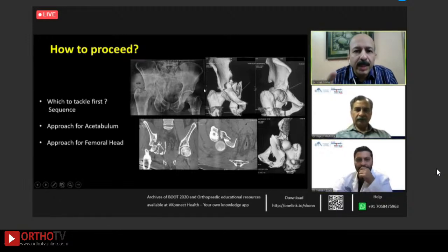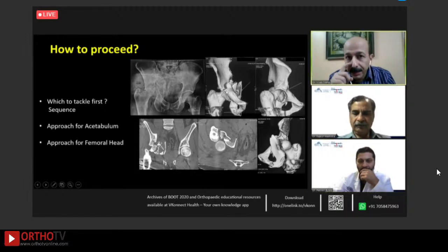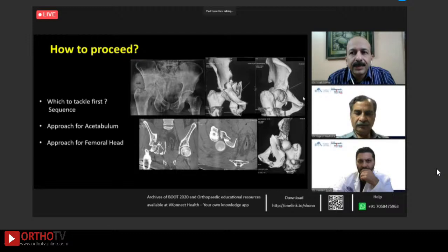Okay, so you will be going all from the back in the initial stage, and you are expecting that you will be able to fix the anterior column also from the back with the troch flip osteotomy. Yeah, especially with the troch flip and the head still out of the socket, you can manipulate the anterior column and get it reduced and possibly fix it with an anterior column screw, and then not have to do the second stage in the front. Okay. Are you going to do a surgical dislocation, or are you just doing the trochanteric osteotomy to give yourself more anterior exposure?